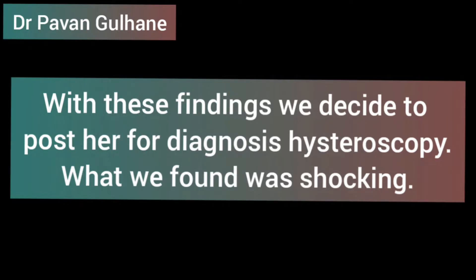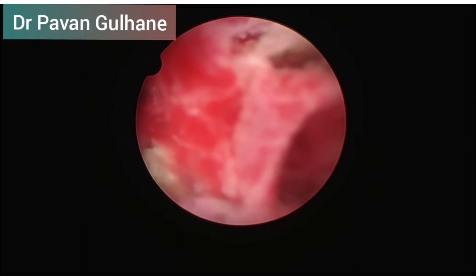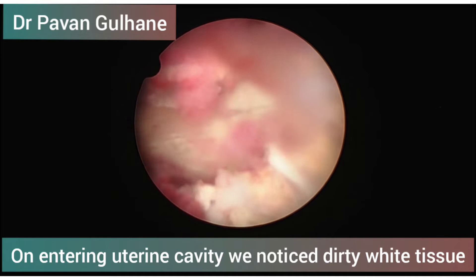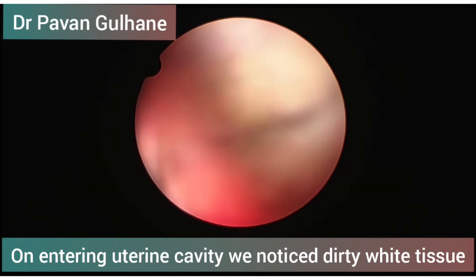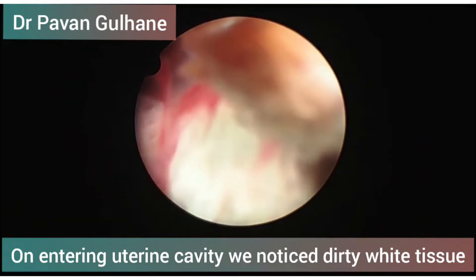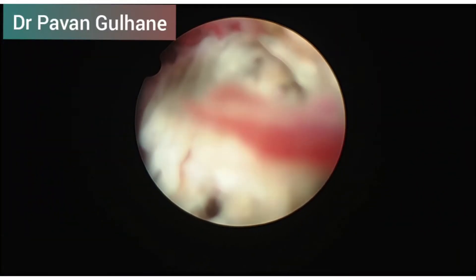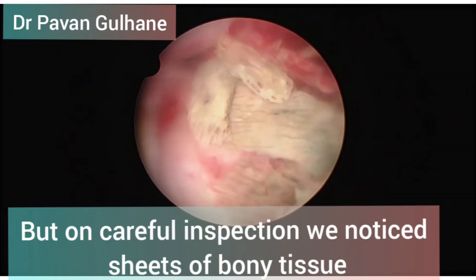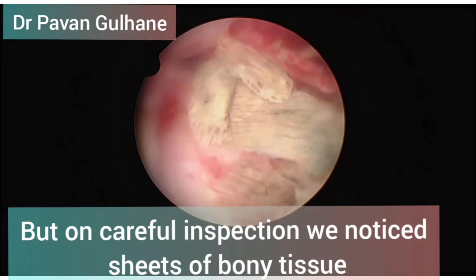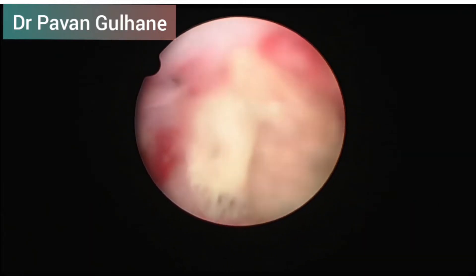When we tried to do hysteroscopy for this patient we saw something very surprising. After crossing the internal os, we realized there was something abnormal inside the uterine cavity which did not look like any normal intrauterine pathology. On close inspection, we realized these are nothing but sheets of bone completely covering the endometrial cavity — these sheets are called osseous metaplasia of the endometrium.